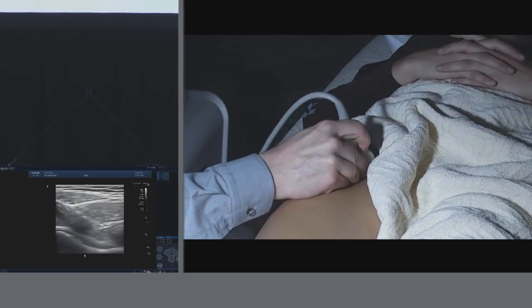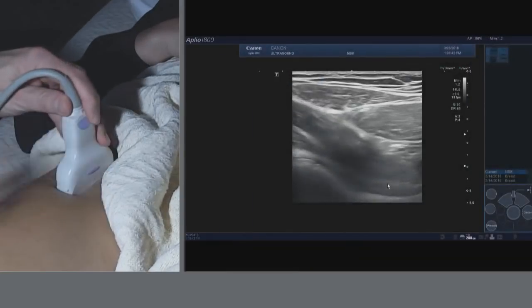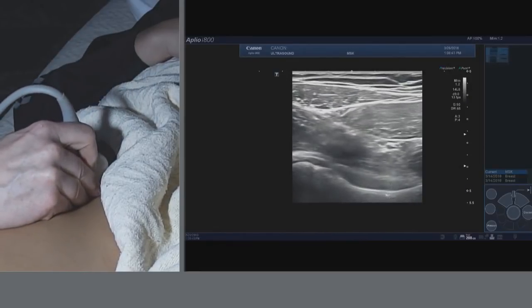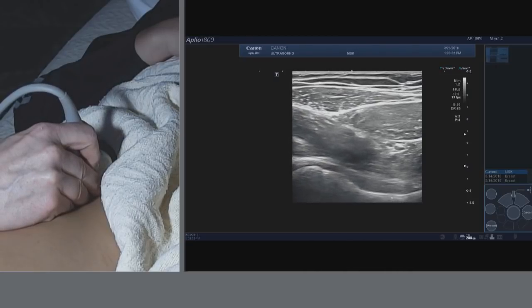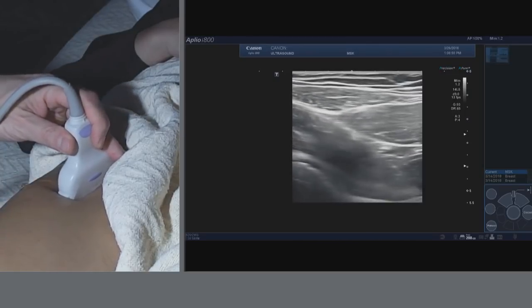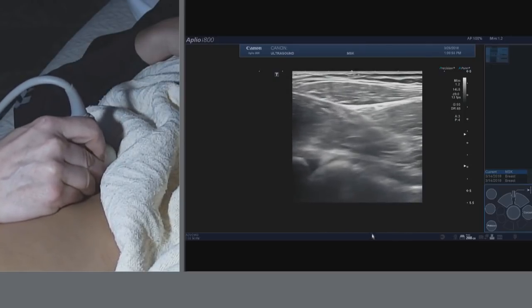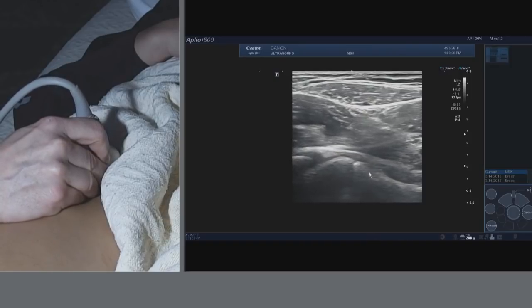So when we're looking for a joint effusion or any joint process, we're focusing over the anterior recess as shown here. Now remember that the normal tissue here can be up to 7 millimeters thick, which is essentially the capsule here that comes down and reflects on itself. So it's important not to mistake this normal tissue for synovial hypertrophy or effusion. That's just normal tissue. Also note in this model here, there is irregularity here at the head-neck junction.